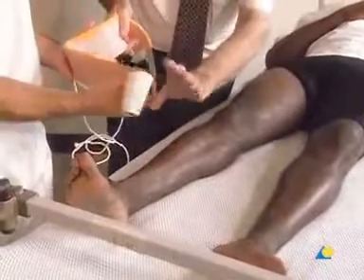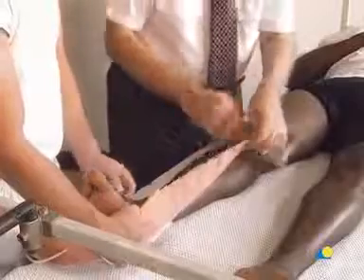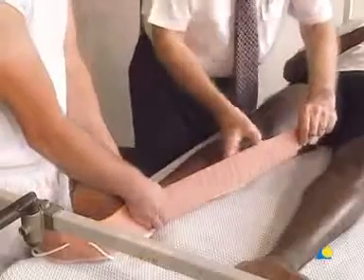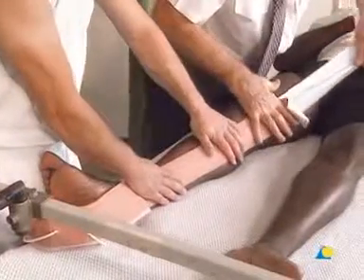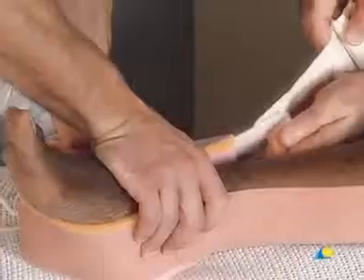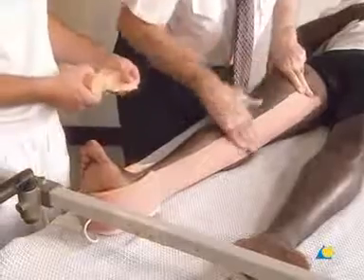The red elastoplast will now be applied. It is important that the elastoplast will not stretch lengthwise. The lower part of the elastoplast is padded to prevent pressure sores forming over the medial and lateral malleoli. The paper backing is removed and the elastoplast is applied on the medial side, proximally up to the groin. On the lateral side, the paper backing is removed and the elastoplast is applied as far as the greater trochanter. Care is taken to verify that there are no wrinkles in the elastoplast, since wrinkles can lead to pressure sores.